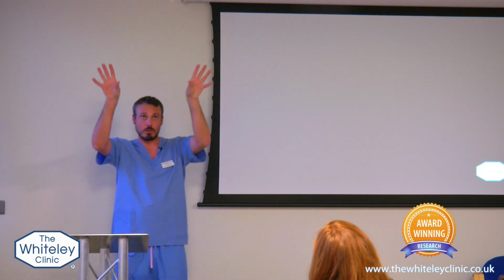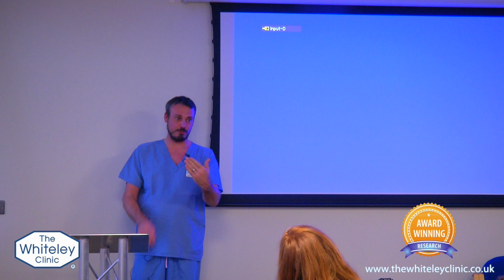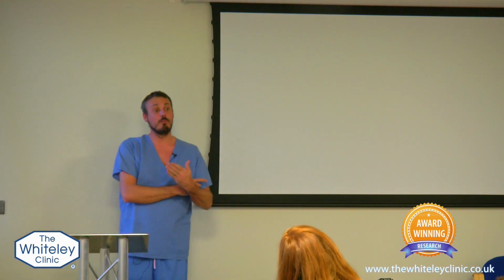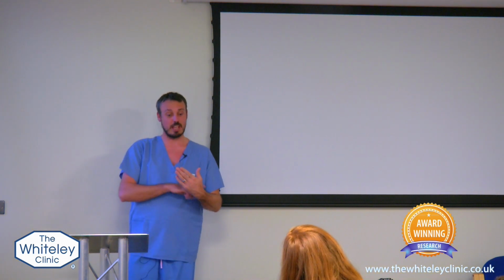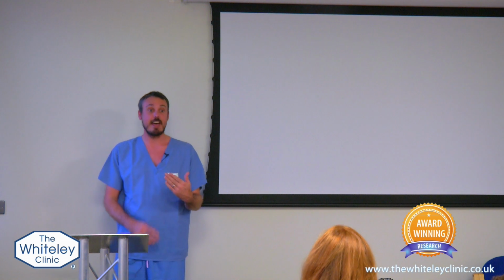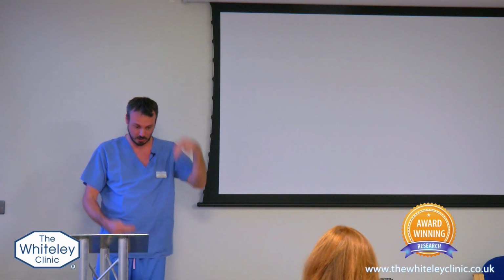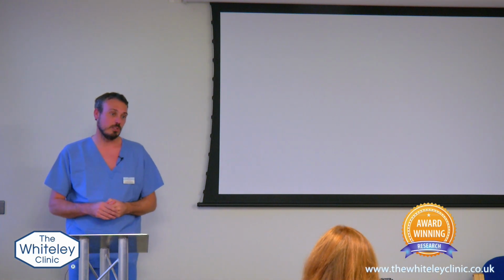But if you imagine 4 territories of veins coming in, and I come into one territory and they're all connected, and I inject foam, all that happens is it shuts down all the other three territories. Now I then need to find those other 3 territories. So actually foam is counterproductive for what I want to do then. The best thing to do, what I found, is to embolize the 3 regions first, or 2 regions, or however many, and then when you're in the final region that you want to deal with, you inject the foam. Because then it's not going to go anywhere, because you've blocked all of the exits with coils, it's going to hang around more in the region that you're going to treat, and you just get a better result.